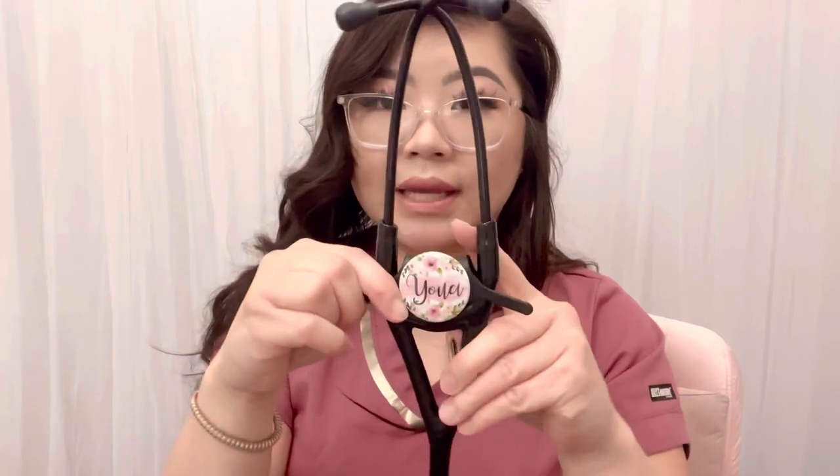Another thing I bought is a little name tag to put on my stethoscope, just to make sure it doesn't get lost. I ordered this from Etsy. On Etsy I'm able to customize my little name tag for my stethoscope. You can choose any design the sellers have, but this is the design I chose. I put my name 'Yua' — I didn't want to put RN or FNP student or anything, because I'm a nurse right now but if I get my nurse practitioner later on I can't change it from RN to NP. So I just put 'Yua' to keep it simple and short.